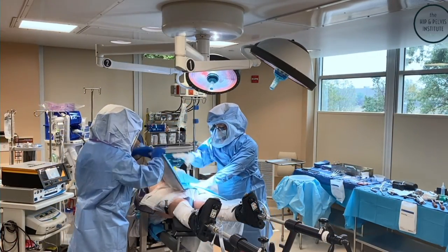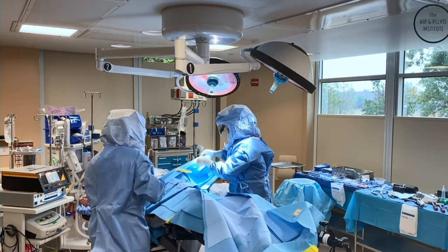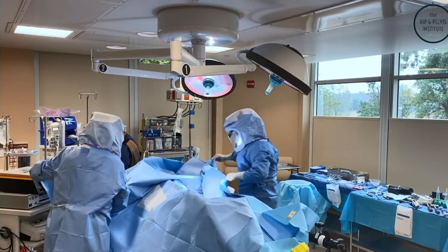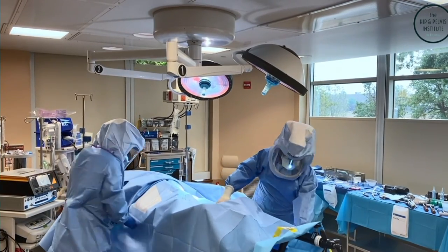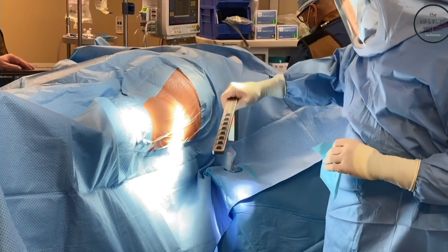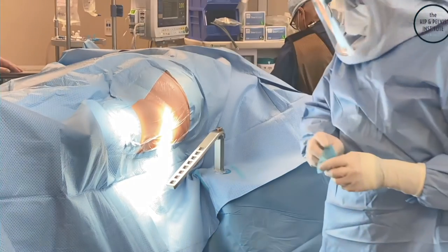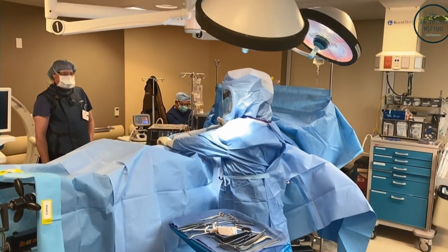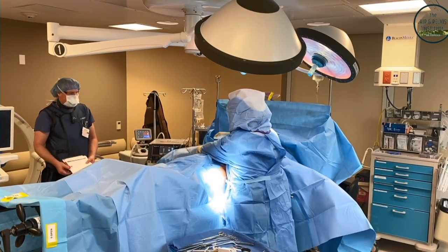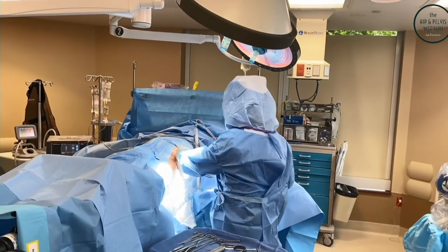Our typical draping setup here. You see, this is just myself and my scrub tech setting up our drape. He comes in a little early, sets up that back table. You can see we're very streamlined just using those two tables. With some advent of some commercially available drapes, this draping time has been dropped dramatically. So we're not typically using an OR scrubbed assist, aside from my scrub tech who's managing the equipment. We're putting on, this is our self-retaining retractor system we're currently utilizing. I'm setting up myself. He's gonna go drape the C-arm.